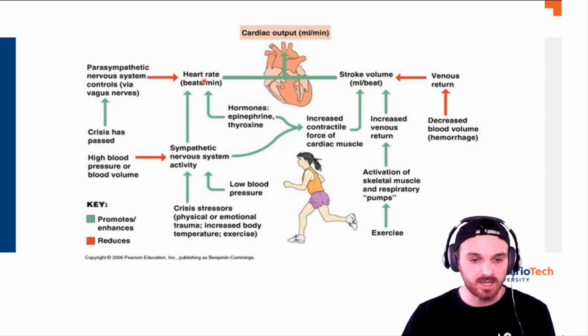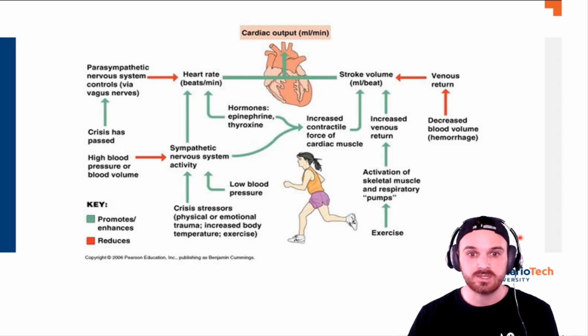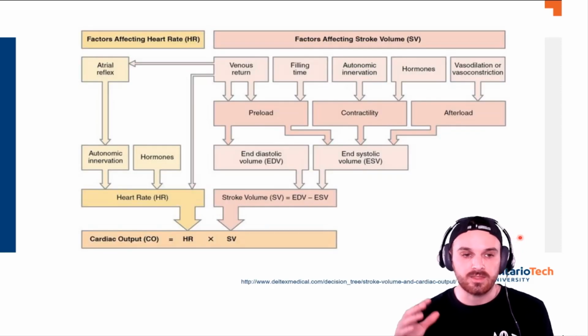And you can see it doesn't have the arrows here, but obviously some of this would then feed back in, because with increased cardiac output, you have more blood going out, and then generally that would lead to increased venous return. So we'll plot some data and we'll look at our Physioflow data and how that maps out after. I just wanted to include this.